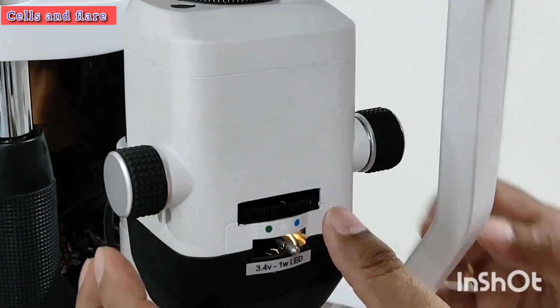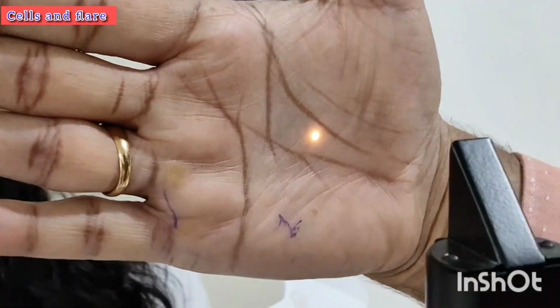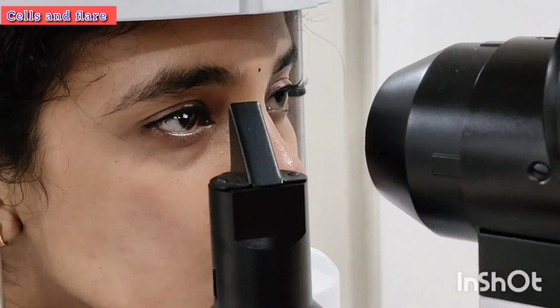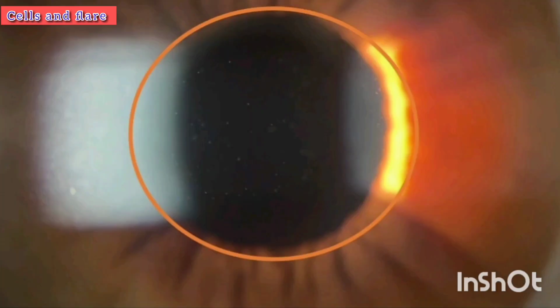To see cells and flare, we have to use 1 mm aperture and maximum illumination. Pass the light from outer to inner margin of the pupil and observe the cells and flare in the anterior chamber.